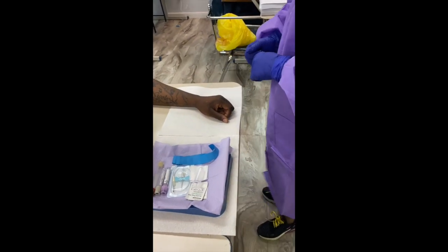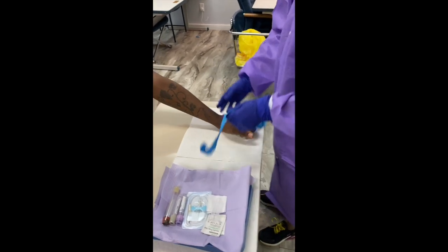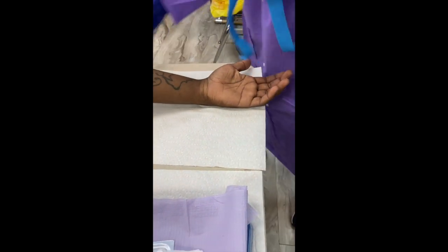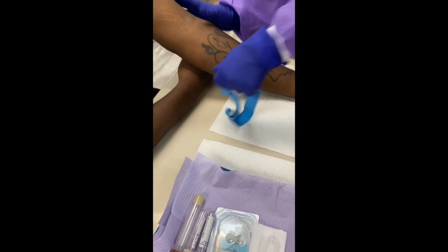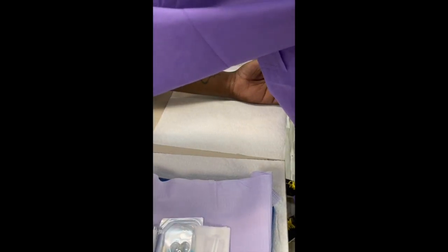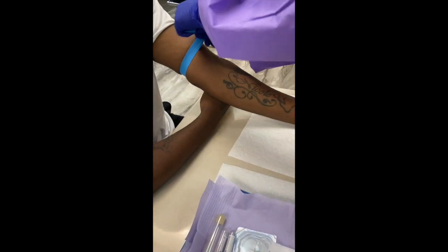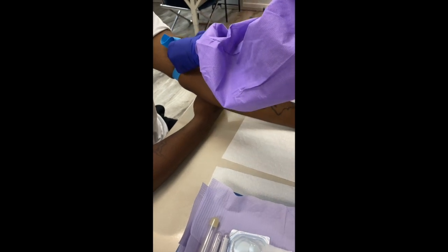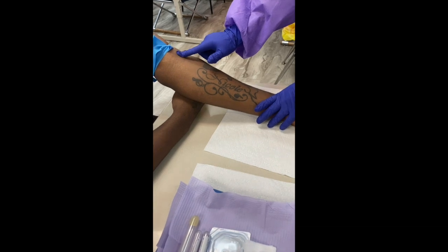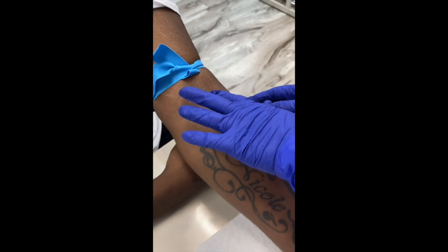Now I am going to take a look at your arm using my tourniquet. I need to make sure I'm going to get the very best vein, and your hand is upwards. I've placed your fist underneath your elbow, which gives you some support. Now I'm going to tie my tourniquet, making sure it's nice and flat so it won't dig into your skin. I'm going to feel around for a bouncy vein — it looks like I found one there.